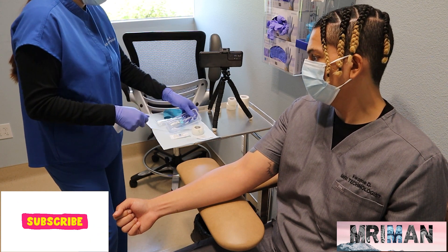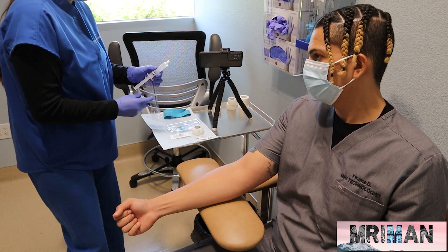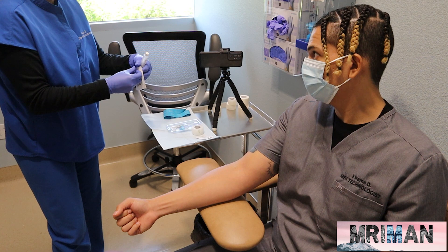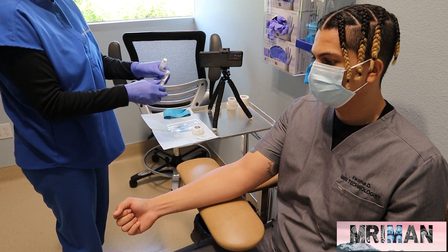First thing you do is have your supplies ready. We have our angiocatheter needle and we have our saline, we have tape, we have alcohol, we have our adapter for our saline flush and we have our tourniquet.